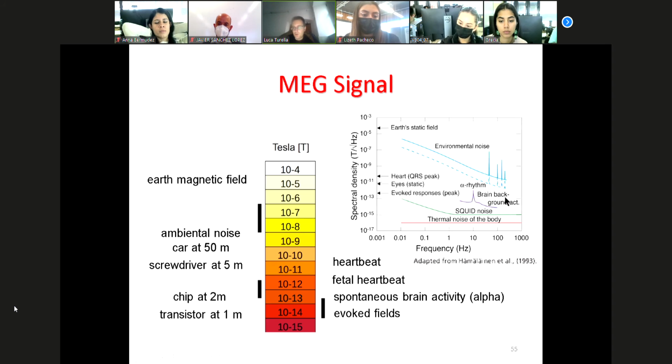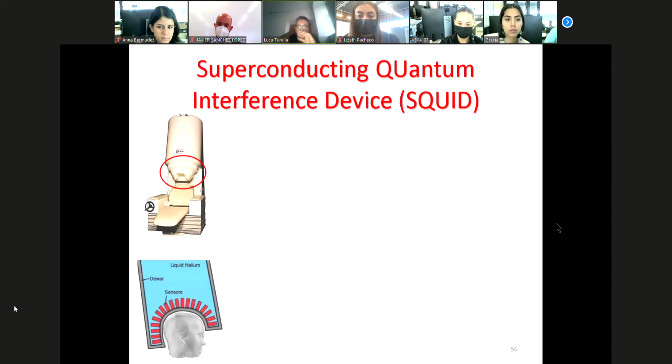This is just to show you the same things that I showed you here, but showing the intensity of the signal at the different frequencies. Okay, the type of technology that all the MEG systems use is the same in terms of the way in which the sensors acquire the data, but there are different types of sensors for different types of MEG. We will come to this later.